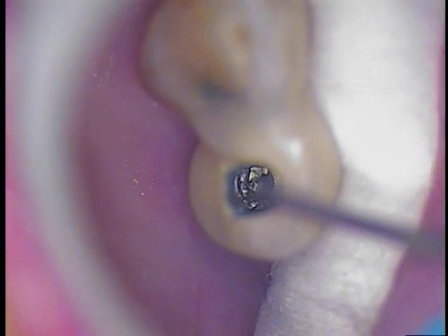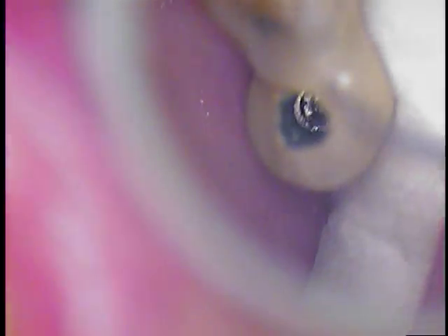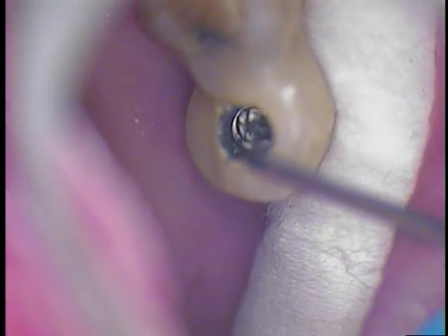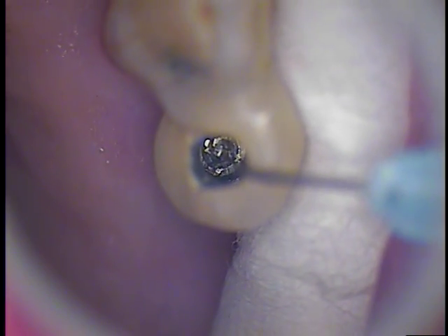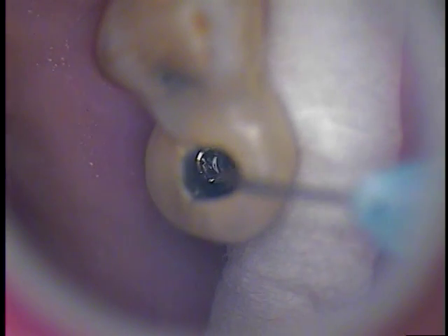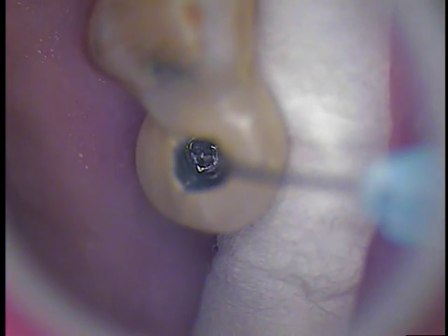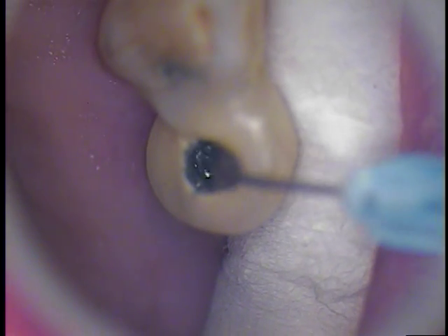Do you feel anything at all? No? I gained a little more access — a little more up the side of the incisal edge. I was able to get in there. I'm going to pre-soak again, because it's too easy to have an issue. I'm going to put a little more of that solution in there. Let it penetrate — it's kind of like penetrating oil in the industrial world, but this is tartar and stain. Now, let's suction that out.